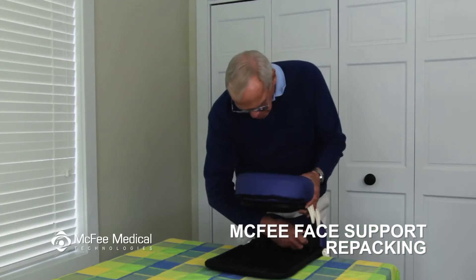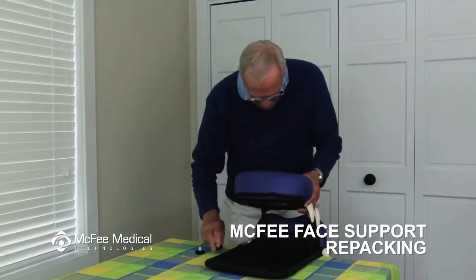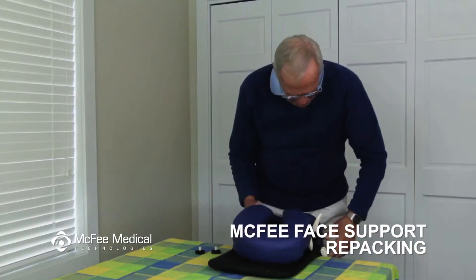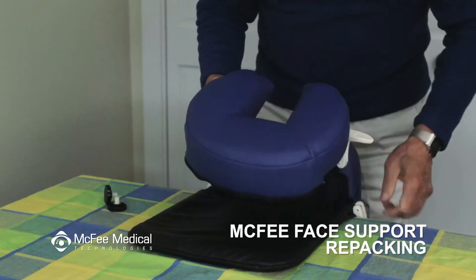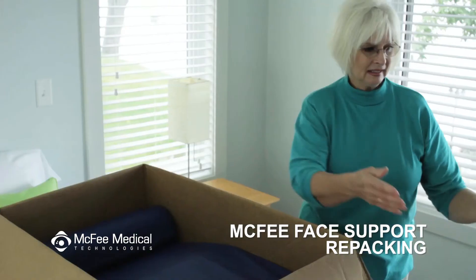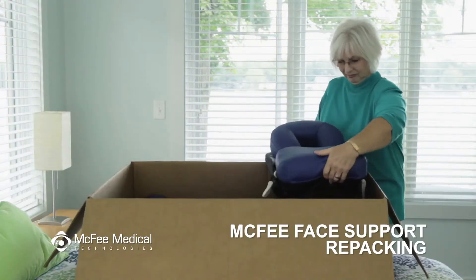To repackage the premier tabletop face support, loosen and remove the two knobs, release all the cam locks, and allow the tabletop to fold onto itself. Then place it flat on top of the sleep cushion in the box as shown.